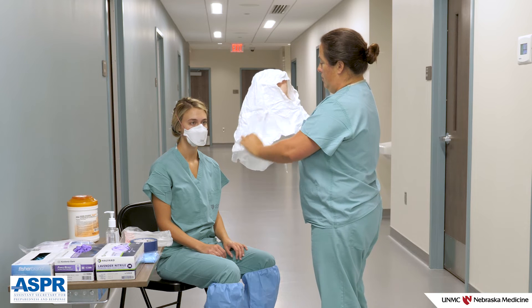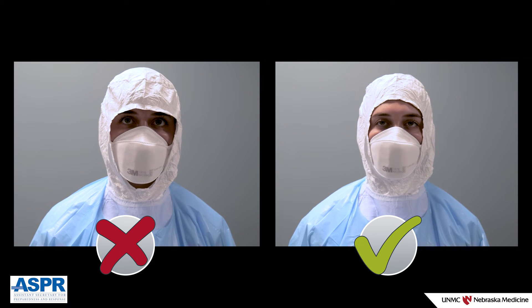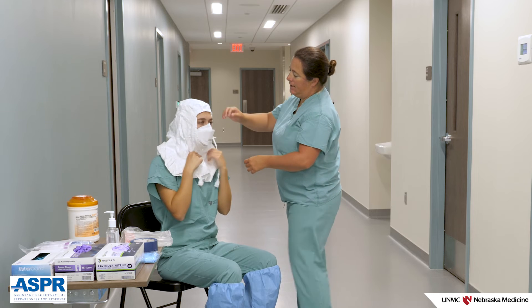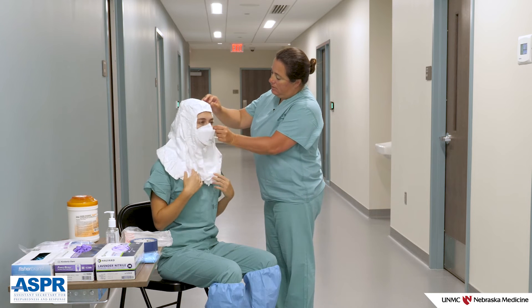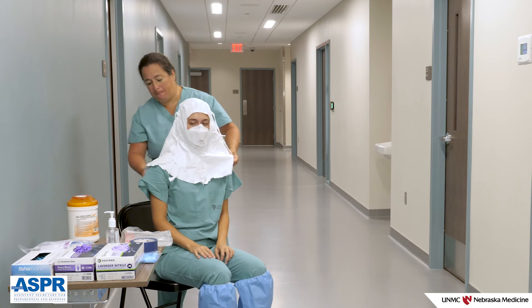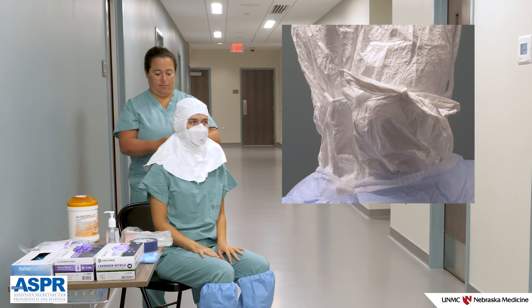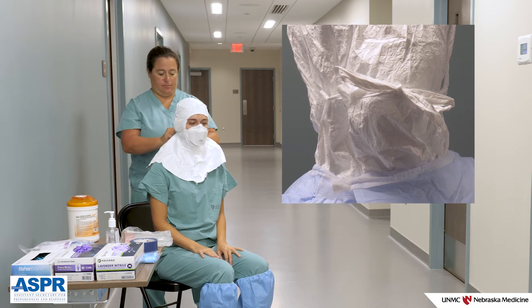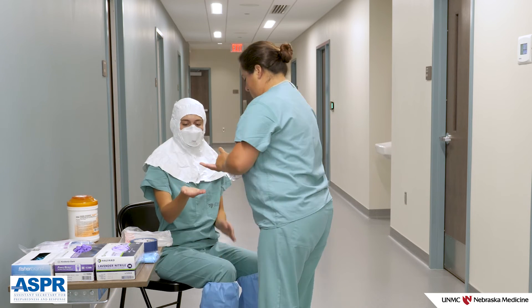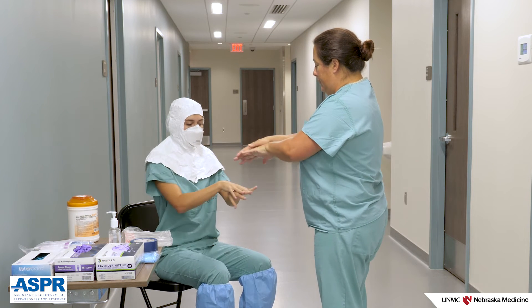You will don your hood next. When donning the hood, position it so it rests above the brow line and does not obstruct your vision. If the hood has ties, be sure to secure them with a bow. Perform hand hygiene. Then put on your first layer of gloves — the inner long cuff gloves.